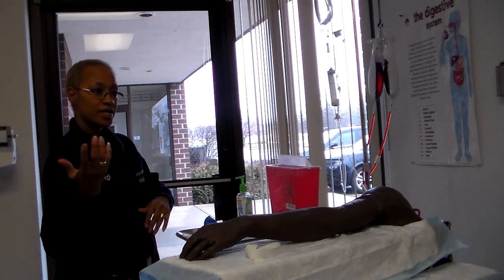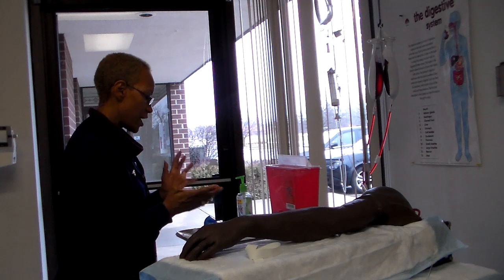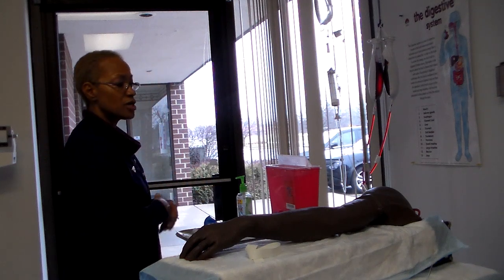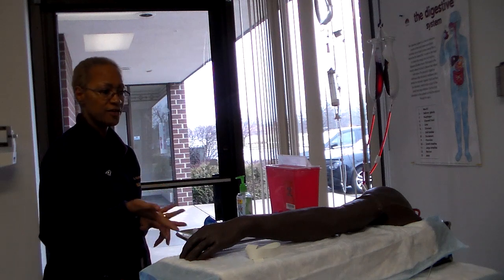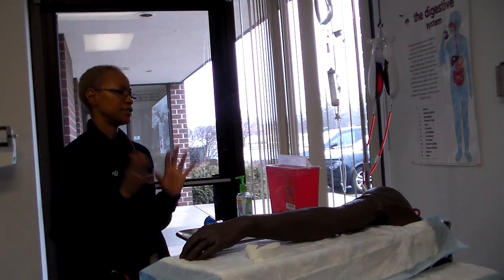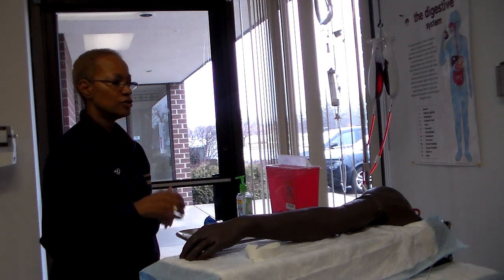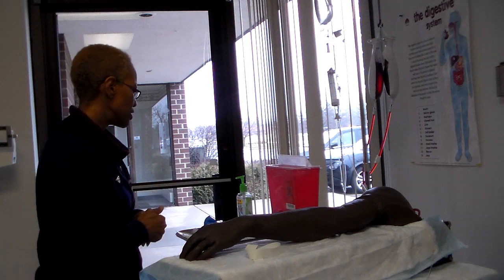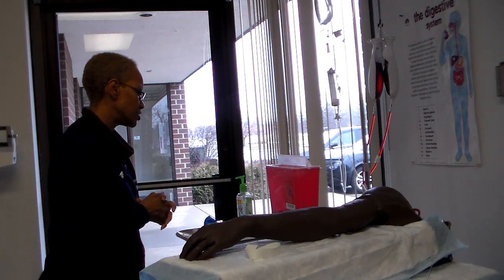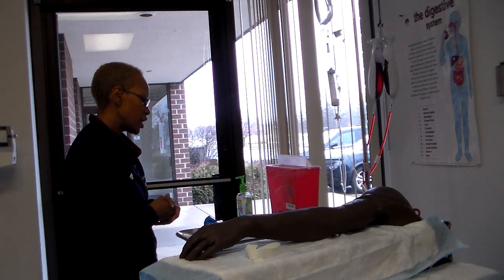If they're right-handed, they probably want it in the left hand. So ask them whatever their preference is. Okay. You're going to ask them also, what was their previous experience? You're going to say, have you had an IV before? And they said, oh yeah, once when I was in the hospital and I had my child. Okay. Well, then you're aware that you're going to get a little stick and we're going to start an IV. And they say, okay, that's fine. So this client says they don't have a preference, so we can put it in either hand.